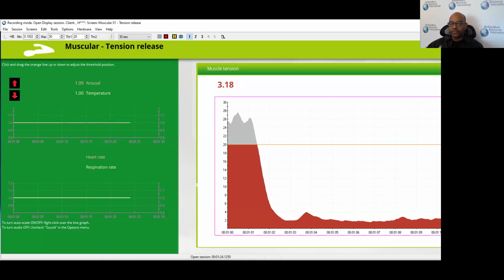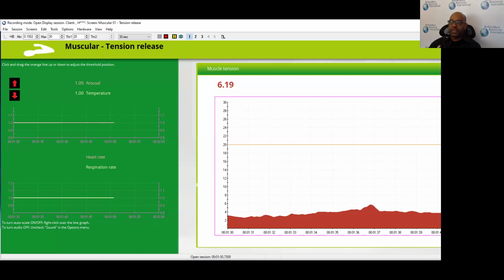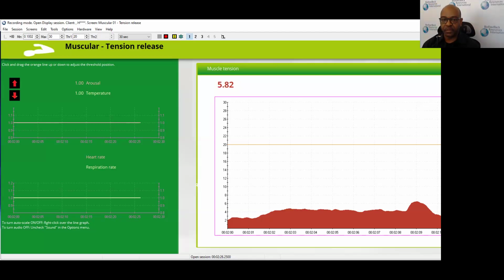Now I'm going to take a breath. Try to take a breath about as deep, and also attempt to minimize the activity of the shoulders this time. So you see there was still some, not as much. So I would keep working on that to see if I can reduce it even more. So that was better. Try another. So I'm really focusing more on using the abdominal muscles when I do that.